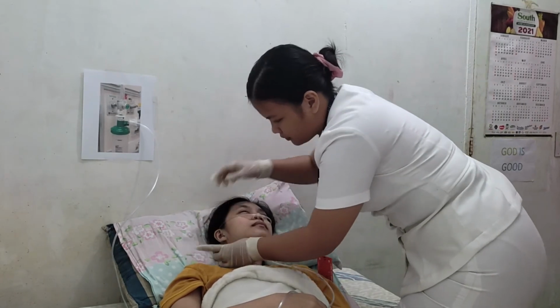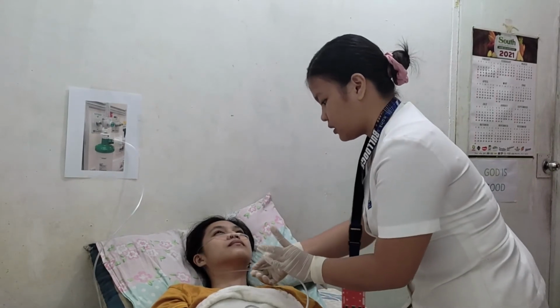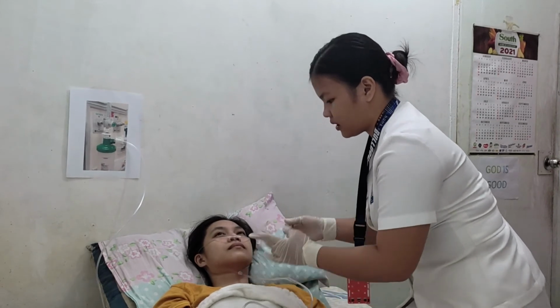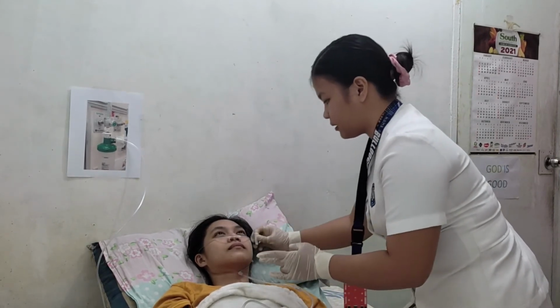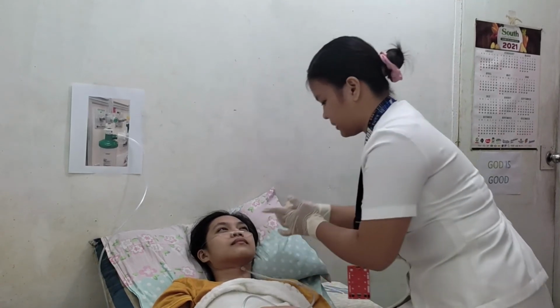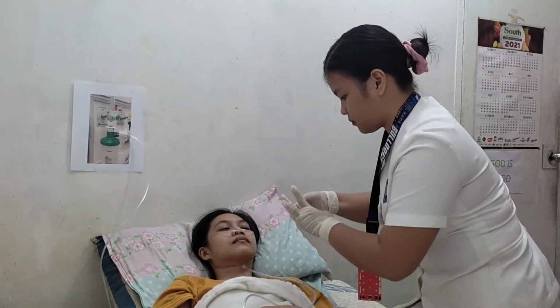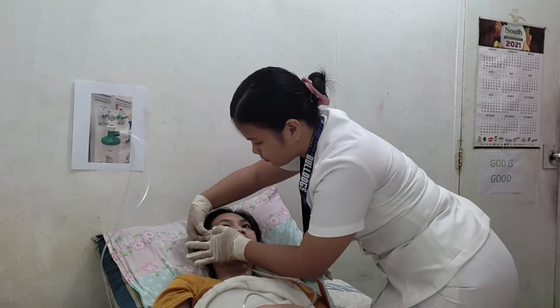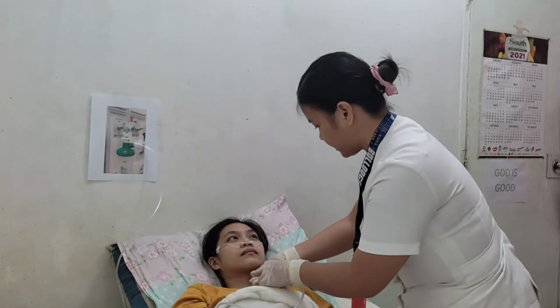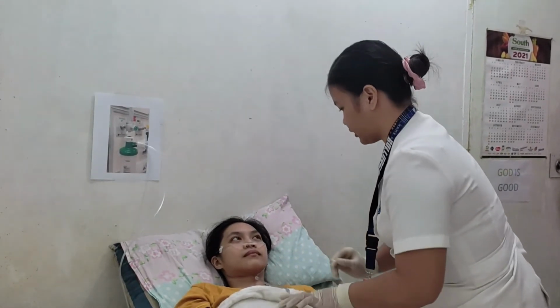Hook it to the ears of the patient, and we can adjust it using the slit ring. And we can put tape to let the nasal cannula stay in place. So it keeps the delivery of oxygen in place, and also ensures that you are receiving the amount of oxygen that you need.